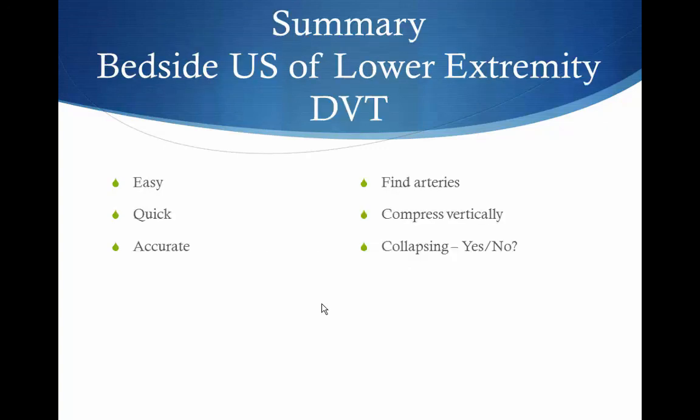So that's pretty much it. I hope you see that this is pretty easy. Anybody can do this, and you can diagnose people quickly, get them in and out. You can avoid extra ER trips, avoid hours of delays waiting on scans to be done and read, or waiting on anticoagulation, or you can avoid anticoagulating people who maybe don't need it by just walking into the room, seeing the patient, doing a history and physical, doing an ultrasound, and diagnosing or excluding it right there, right then, done. So it's easy, it's quick, it's accurate.